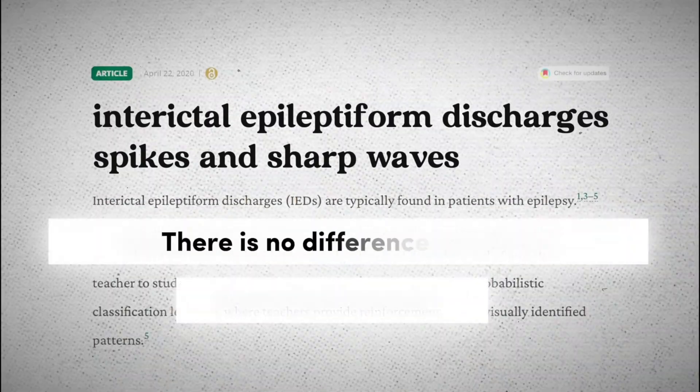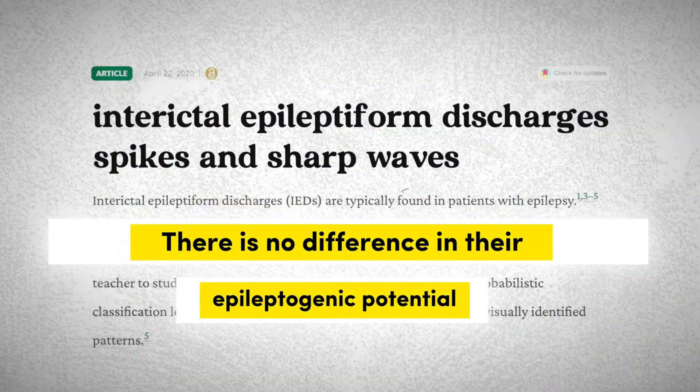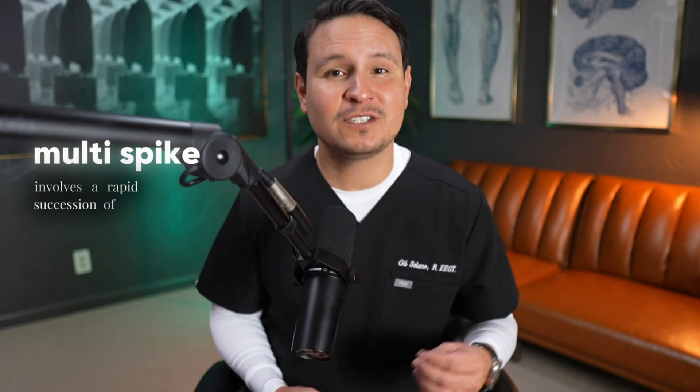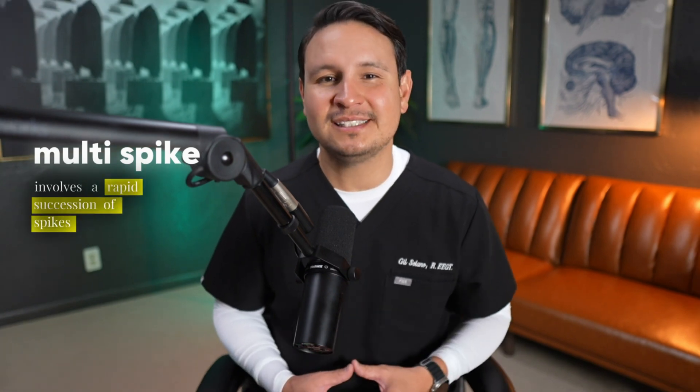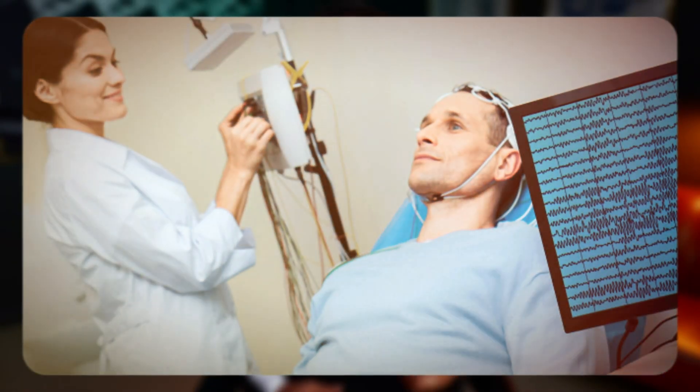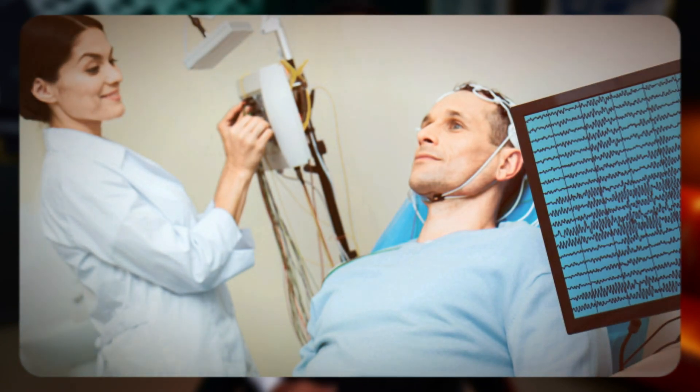Despite these differences in appearance and duration, there is no difference in their epileptogenic potential — they both signify the same level of risk for epilepsy. Another common type of IED is the polyspike or multispike, which involves a rapid succession of spikes, and these can often be seen in patients with specific types of epilepsy and may occur in combination with other IEDs at different times.